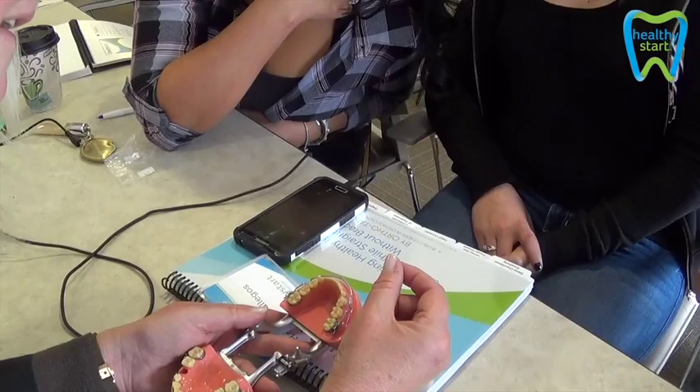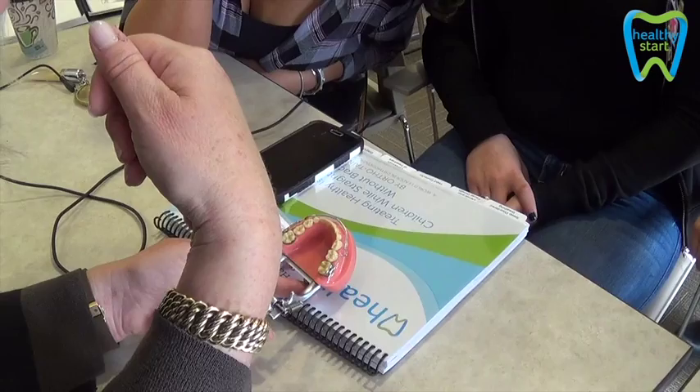The chain placement is determined by handedness. For right-handed patients, you want the chain on the left side, because you want the right hand free so they can brush. So if I'm right-handed, it's easier for me to pull this out and brush my teeth. If I'm left-handed, I probably want the chain on the right side and leave the left side open.